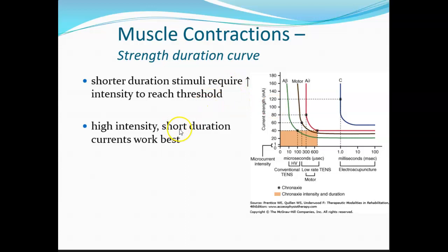Anyway, here's the outcome. What I want you to know about chronaxy is that's the measure. You can know what it is. It's 2 times rheobase. But ultimately, that's what's used to compare different neurons and how they respond, or what their threshold level is to electrical currents. And so when you look at these shorter duration stimuli, these are the 2 takeaways.